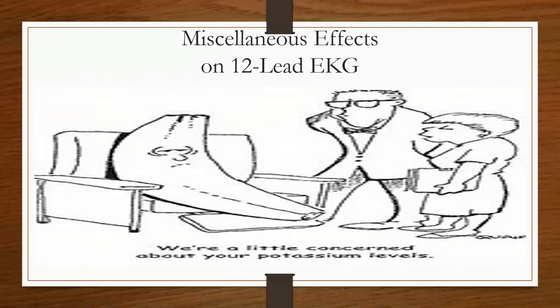Usually when you talk about miscellaneous effects, you're going to be talking about medications and how they alter your EKG, such as digitalis, and your electrolytes, your calcium and potassium. Those are our main two.